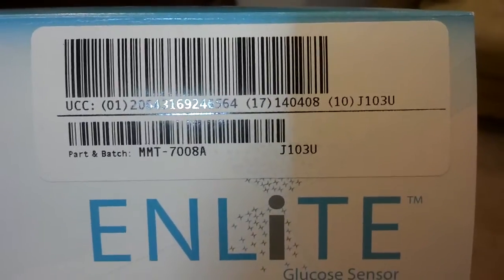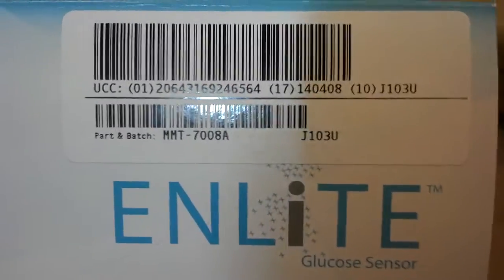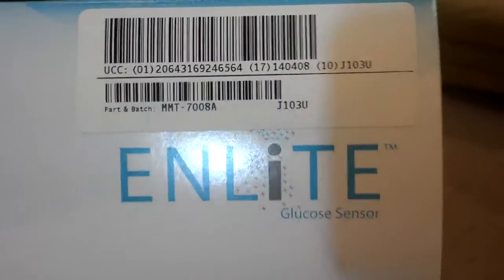I'm taking this video for the people at Minimed or Medtronic, hoping that they can use this information to fix these. I've worked in manufacturing. I know a manufacturing defect when I see one. This is not the way these are supposed to work.